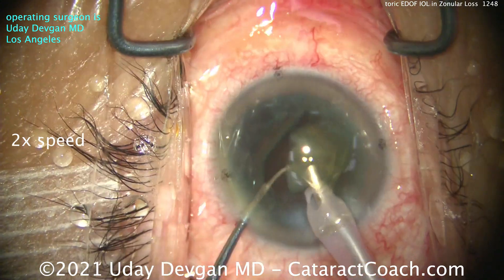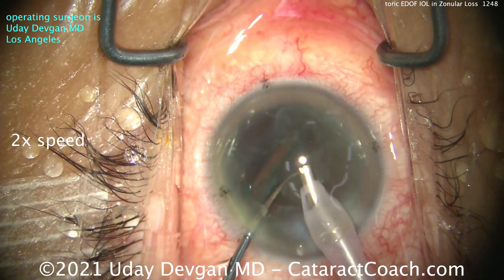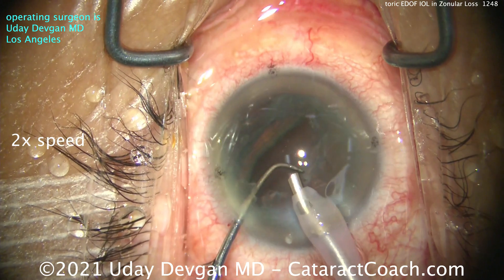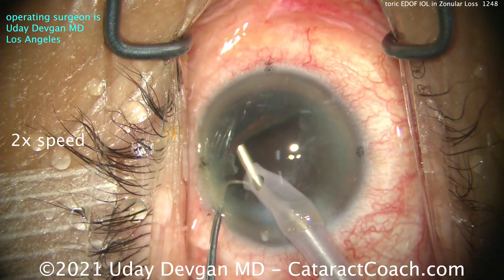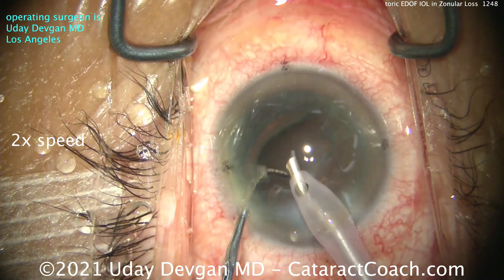I want to get the nucleus out quickly before something else happens. What are the options here? Look at that — stop. I know better than to continue. Stop right there. Big epinuclear shell still in the eye. What should we do?